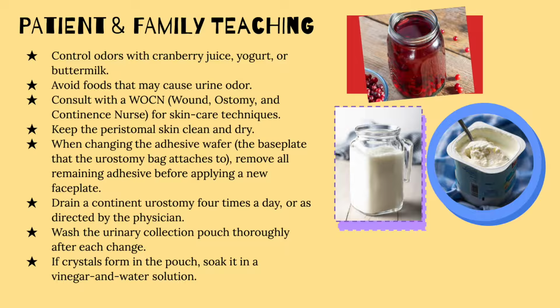When changing the adhesive wafer, the part that holds the urostomy bag in place, they should remove any excess glue that's still left on the skin from the previous urostomy bag application before applying a new faceplate. For patients with the continent urostomy, teach them to drain the pouch 4 times a day or follow their physician's instructions. Finally, educate the patient on how to properly clean the urinary collection pouch. It should be washed thoroughly each time it is changed. If crystals form in the pouch, they can rinse or soak it in vinegar and water solution.